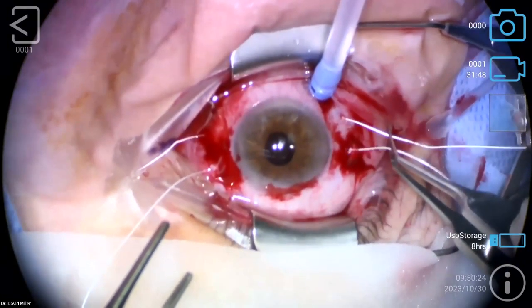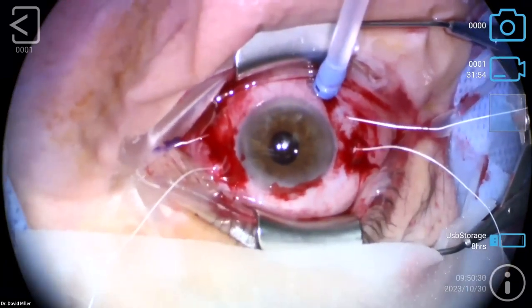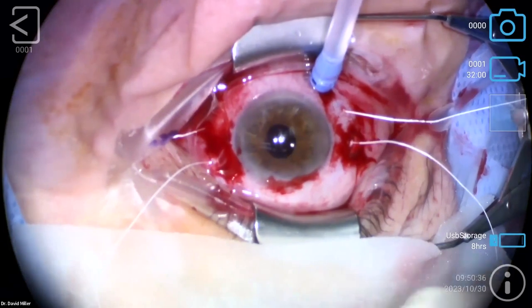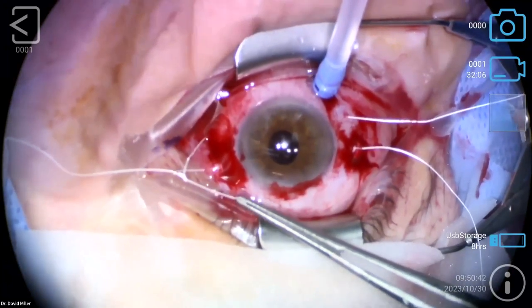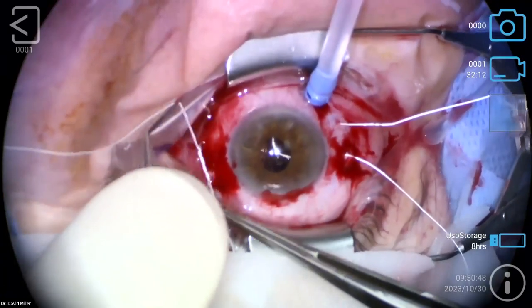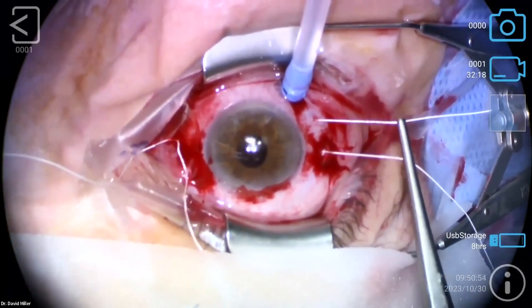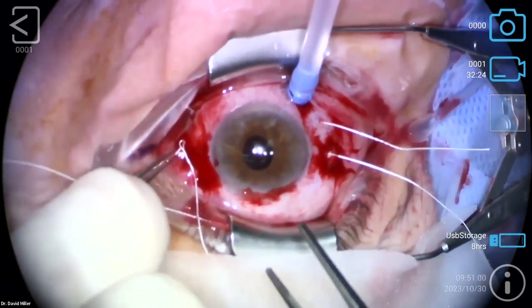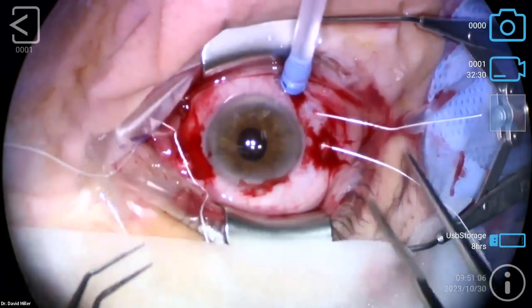I'm going to start over here a little bit, because when you cinch this knot down, you're always going to pull a little bit to the side. I'm going to use another instrument besides my Bonaccolto here. See how it moves over? You don't want to just tie the knot down and think you're done. You want to play with this knot a little bit so that you know you're not too tight.